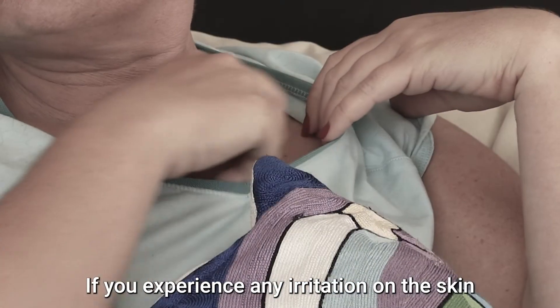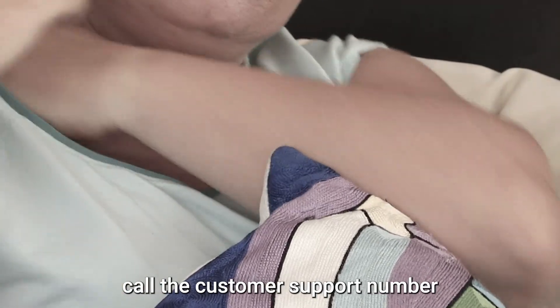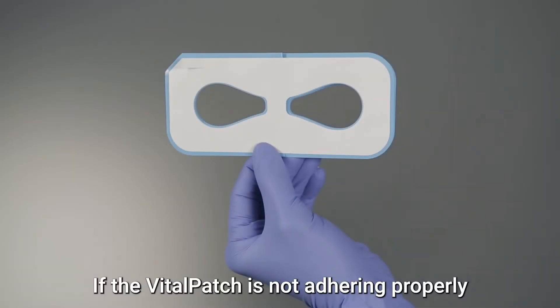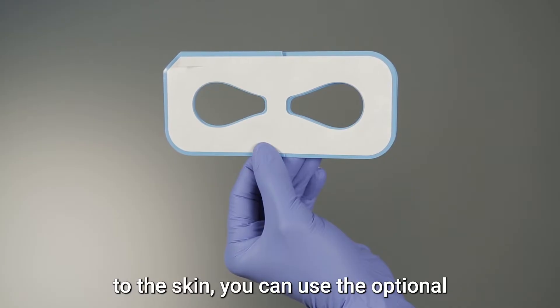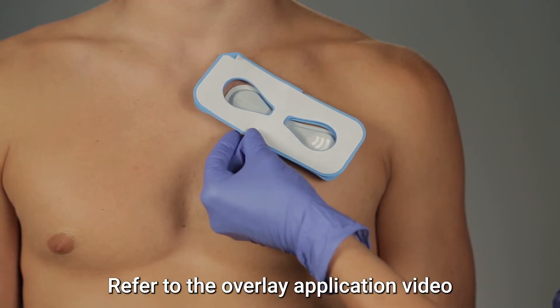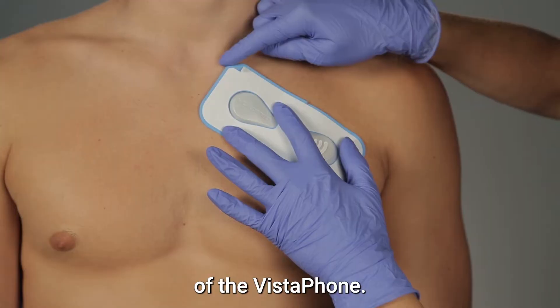If you experience any irritation on the skin around the patch, or if the patch begins to lift off, call the customer support number printed on the monitoring kit. If the Vital Patch is not adhering properly to the skin, you can use the optional adhesive overlay provided in the kit. Refer to the overlay application video available in the help menu of the Vistaphone.